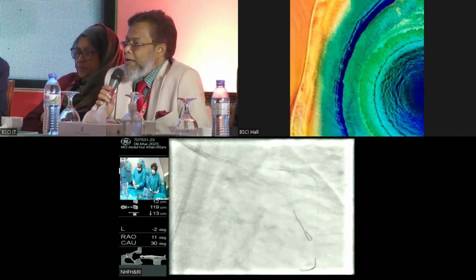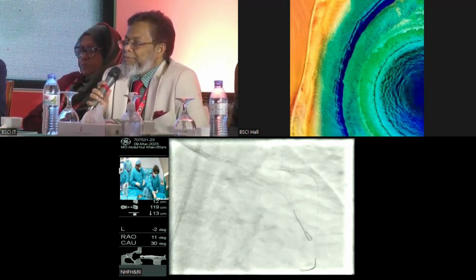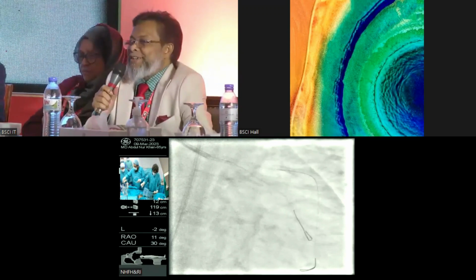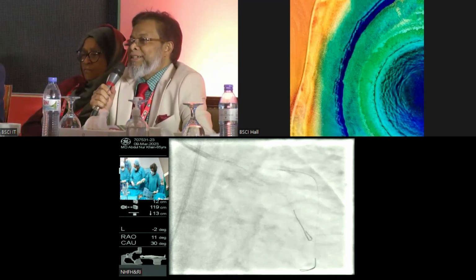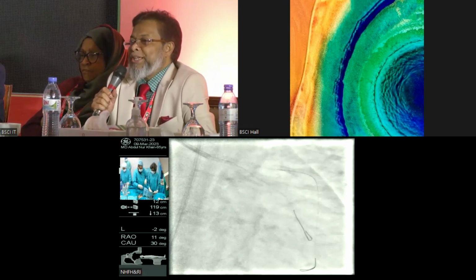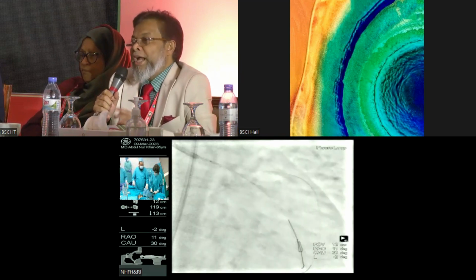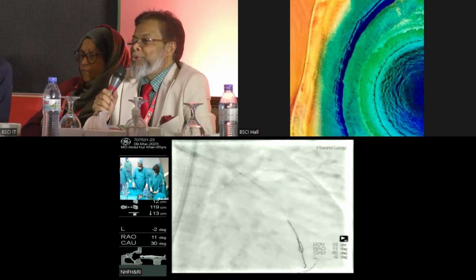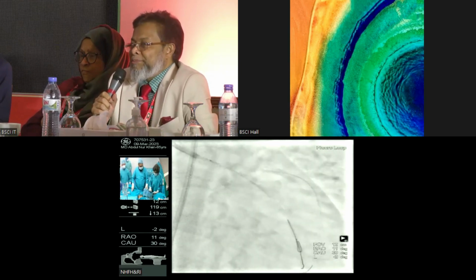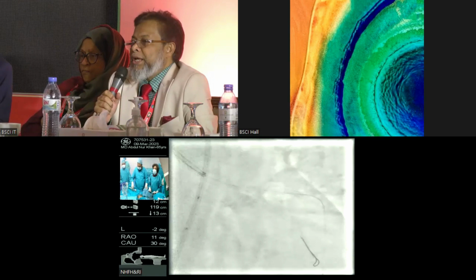Mir Jamal sir, one important issue is the pressure of the POT for aorto-ostial lesions. What should be the pressure for POT? Pressure is always high. POT means the stent size in relation with the vessel size. The balloon will be in relation with the vessel size. If my vessel is 4.5 and the stent available in my lab is 4, then I will never be able to make it 4.5 without POT. Then I shall have to take a 4.5 balloon to adequately cover the wall. And regarding pressure, it should always be higher pressure.